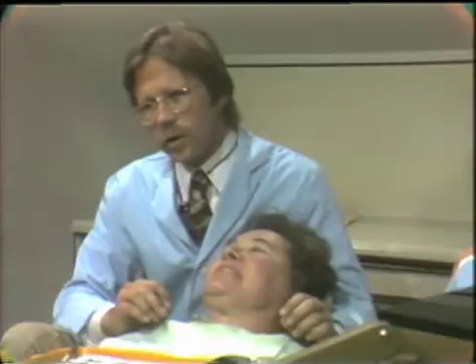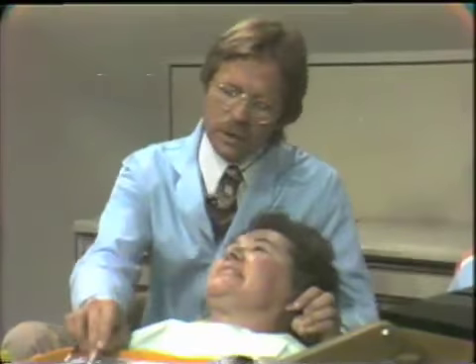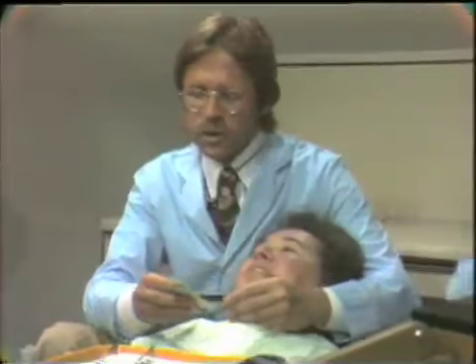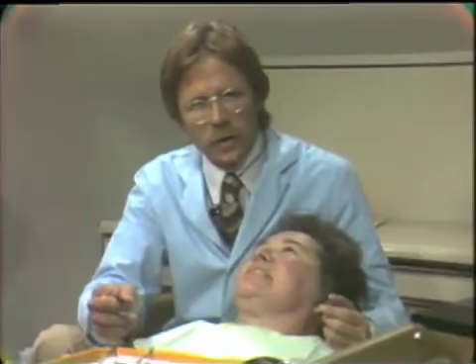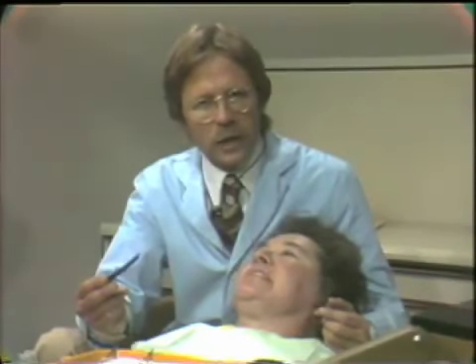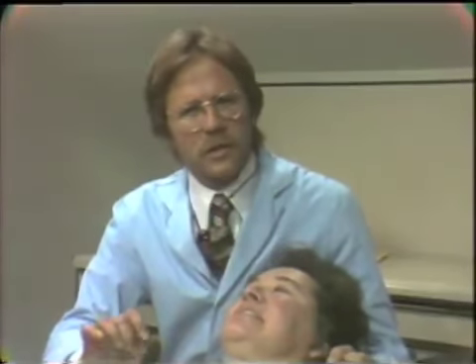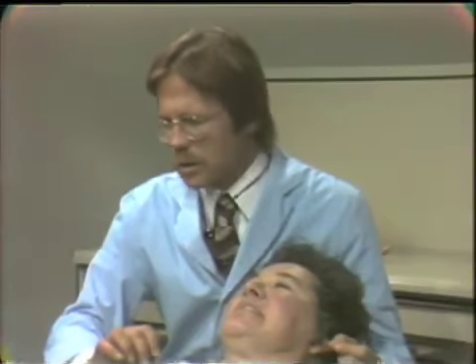We should also record the prematurities on this patient, and this could be done with articulating paper or shim stock or some suitable type of indicating material. Now, the articulating paper will do very nicely, and I'm not going to go into that any further at this point, but prematurities in centric relation should be recorded on the patient's chart.